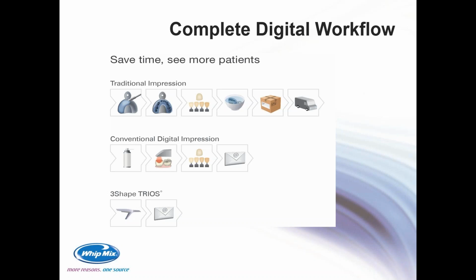You take a look at this screen, and you can see the steps that are eliminated when a dentist is taking a digital impression. But the communication, as you can see, is almost immediate. And you can see a scenario where literally the doc takes an impression, he sends it to his lab, the lab almost instantly receives an email that they have a new case. They can then download or open the file and check the accuracy of the impression while the patient is still in the chair. And it's this type of immediate communication that benefits the patient, the lab, and the doc.